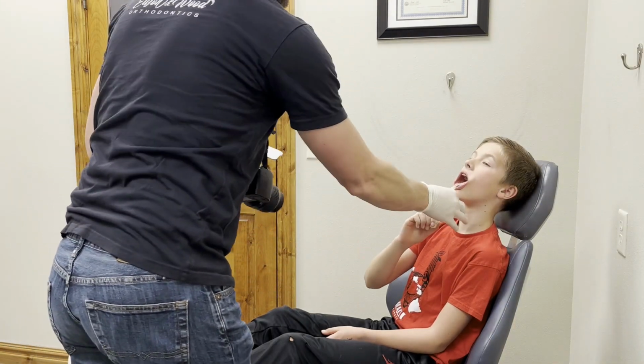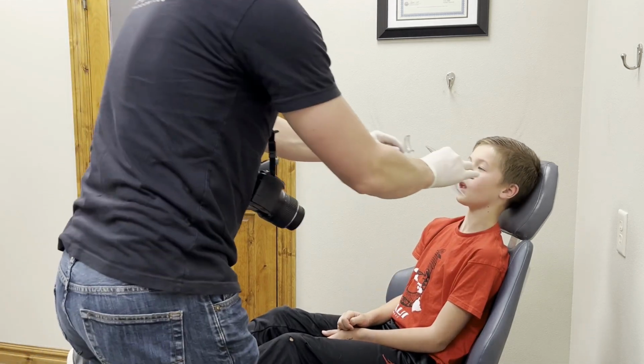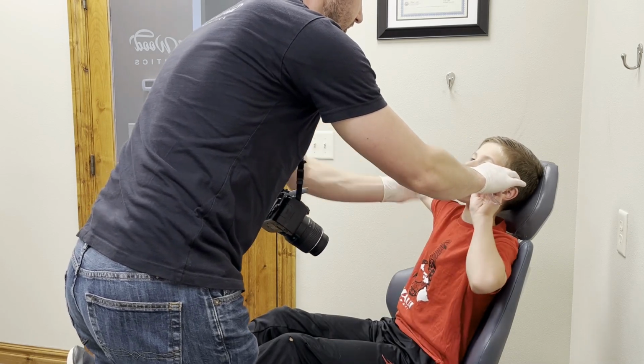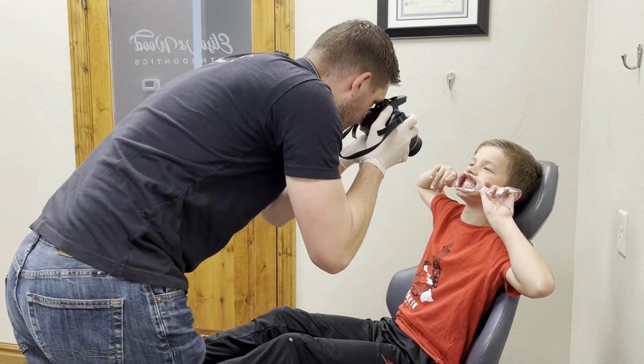Perfect. Now I'm going to switch out for these. And go ahead and open. We're just going to slide these in here like this, one on each side. And go ahead and hold on to those for me. Turn straight toward me here. And bite together on your back teeth. Yep, just like that.